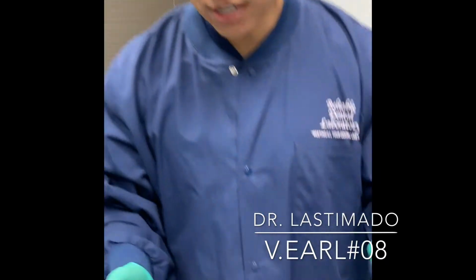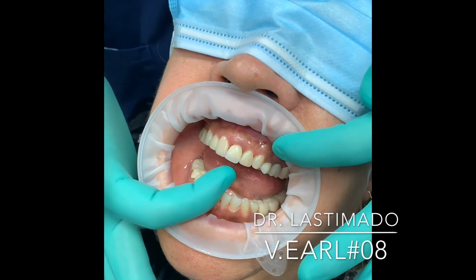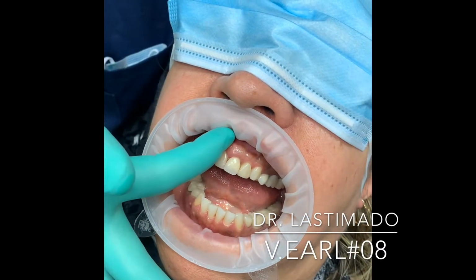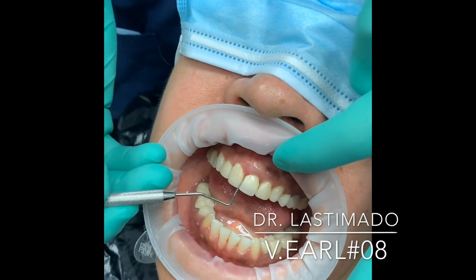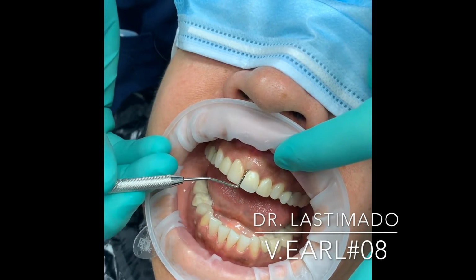Yes, as you know, a VERL is a video pearl, and we're doing a nice advanced anterior surgical procedure this morning. I just wanted to shoot a little VERL with you. As you'll see here, we have our very kind mystery patient this morning. We have essentially a tooth number 9. Number 9, unfortunately, has a 15 millimeter perioprobe depth, and there's some bone loss right on the distal buccal area, as you can see.